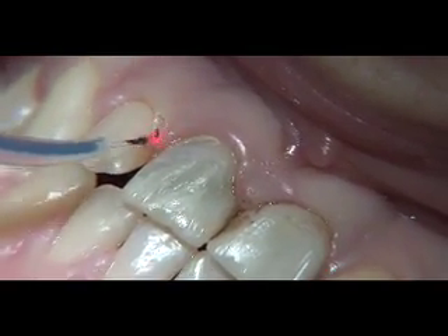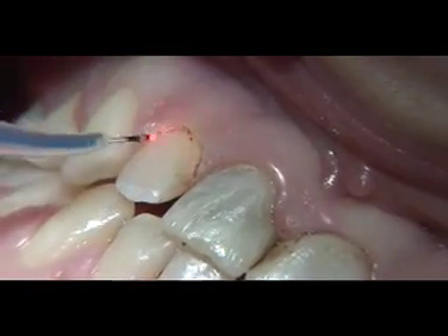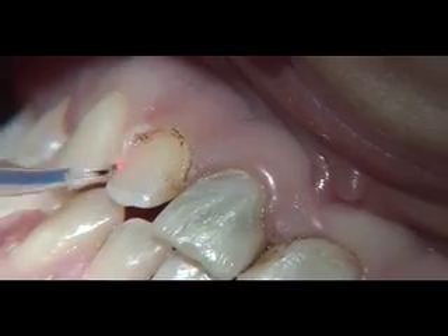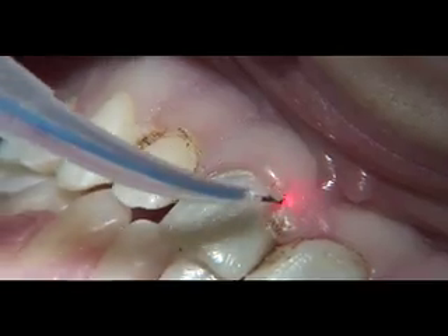Excessive interproximal tissue buildup is an issue here, as is poor golden proportion tissue height and gingival contours. We tackled all three soft tissue concerns utilizing 1.4 watts set on CW mode with an initiated tip.